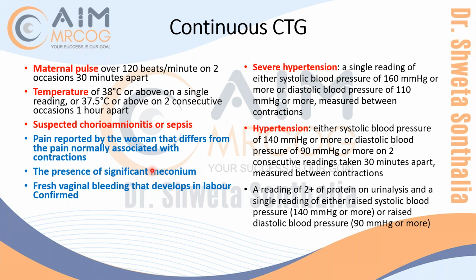Significant meconium. Now the word significant is very important. Thin meconium is not important. Significant meconium means thick meconium, dark green or black in color. So that's significant meconium, a lumpy thing when it comes out. So they say in the presence of significant meconium. These are the words you have to take care of, the words they use which make things difficult. Because if I don't know the meaning of significant meconium, then even with thin meconium I will say that I'm worried for the baby. But thin meconium is acceptable. Significant meconium is thick meconium, where you have to do continuous CTG.